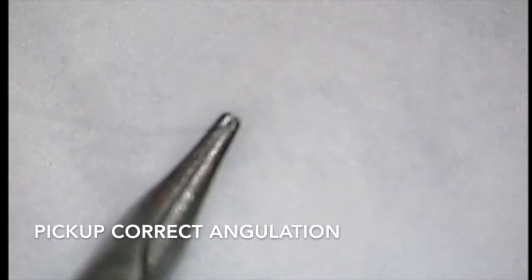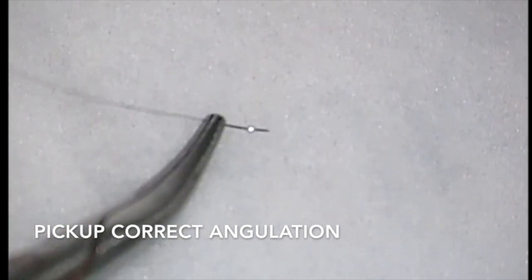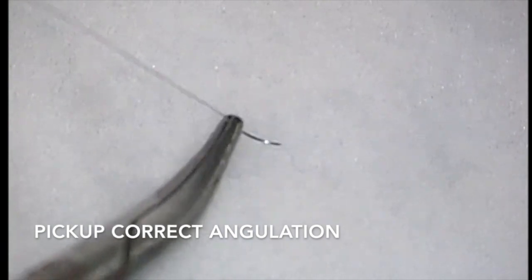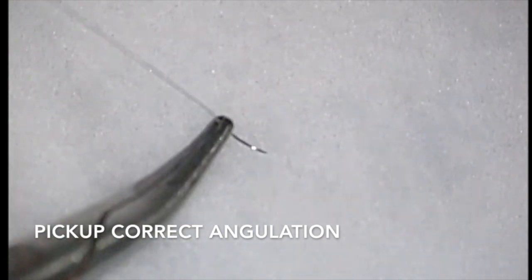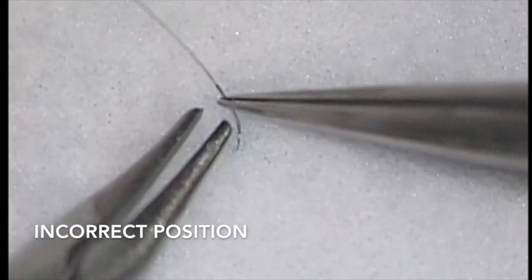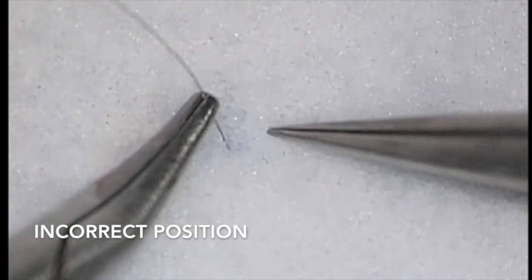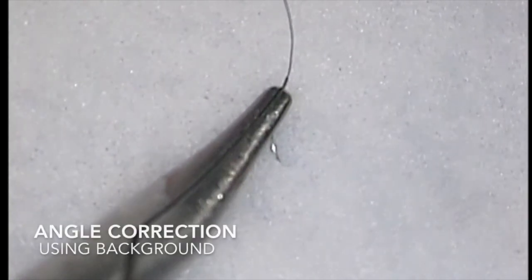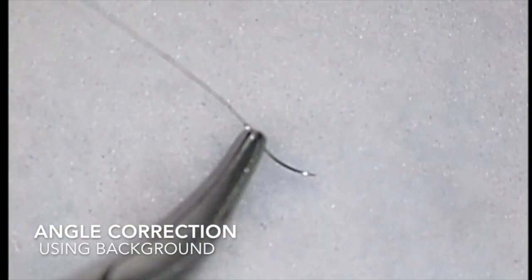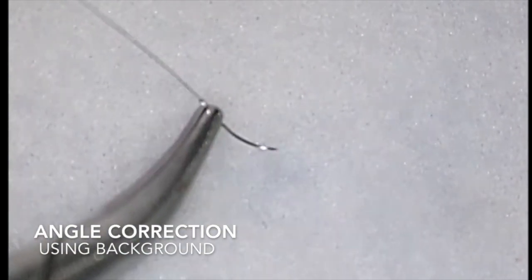So to recap a little bit, I think I asked you at the beginning how much micro you did. You did a fair bit. Got you into the microscope, starting on the artery, and I can tell very quickly whether somebody has the hand-eye coordination, the skills to be able to complete the microsurgery. So we use a double clamp technique because it just controls the vessels, and it means I can eliminate one aspect when we're instructing trainees. You put your first stitch in.